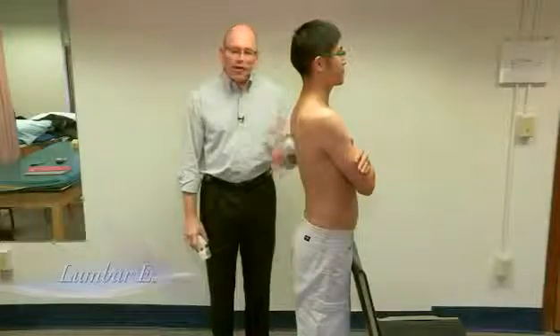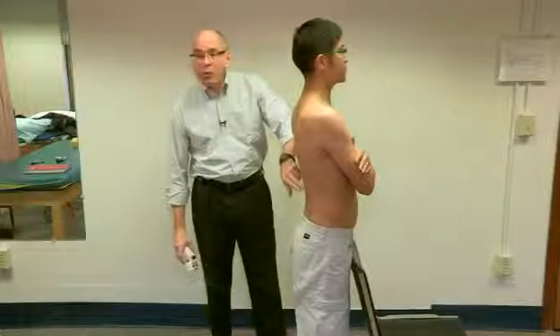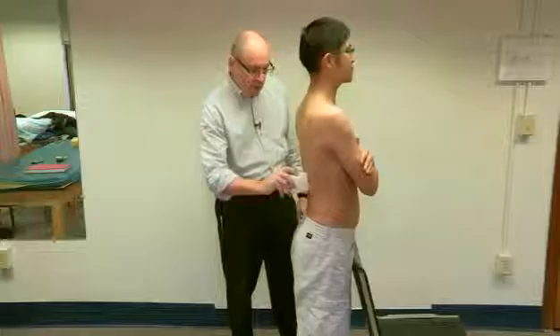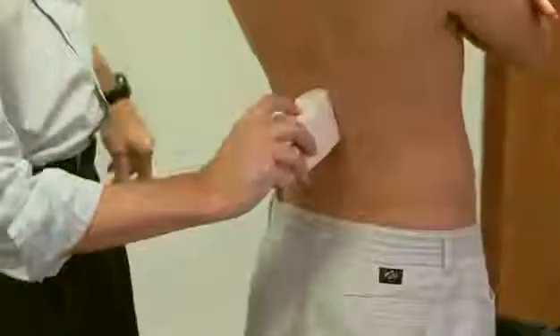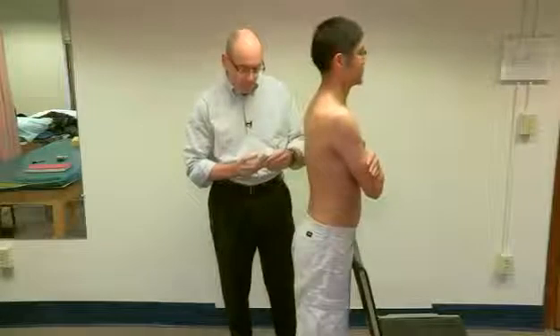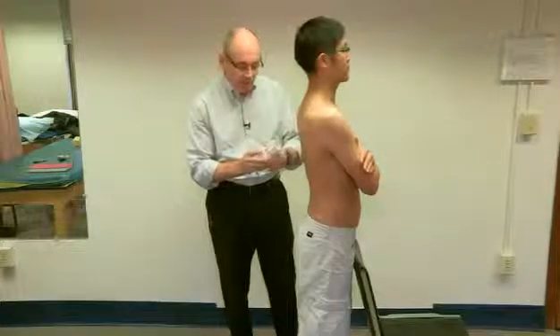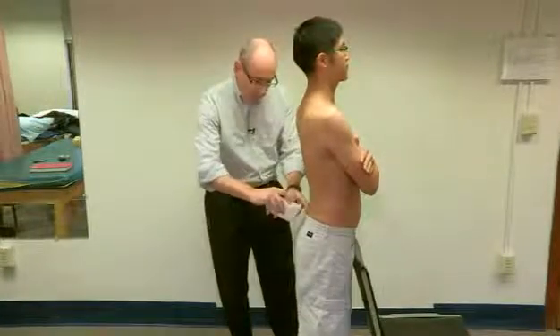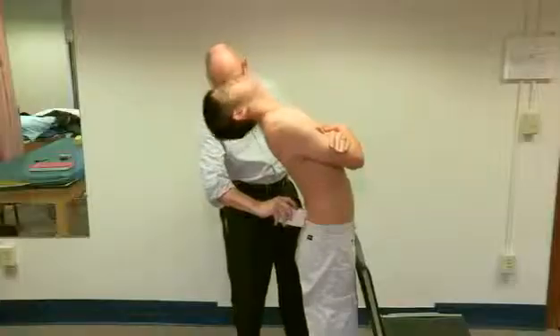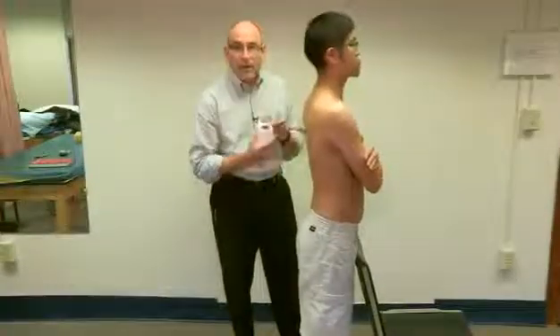Now we're going to measure lumbar extension. We again use our 15-centimeter line rather than T12 because it's easier to find. I place the inclinometer there and set it. Lean back as far as you can. We end up with 20 degrees. We then reposition over the sacrum to find what's happening at the hips and also obtain 20 degrees.